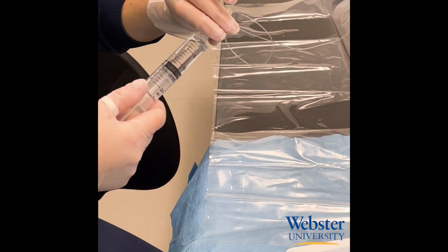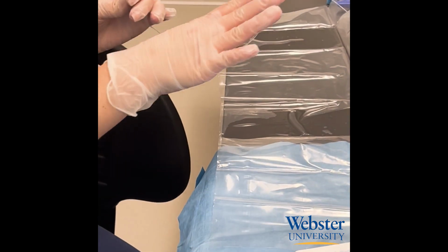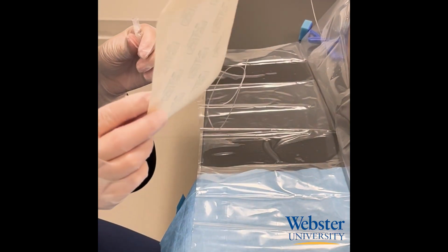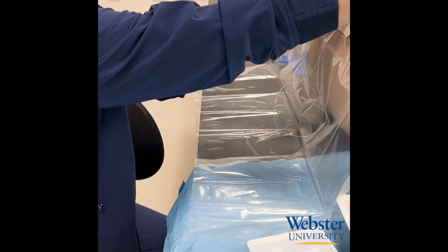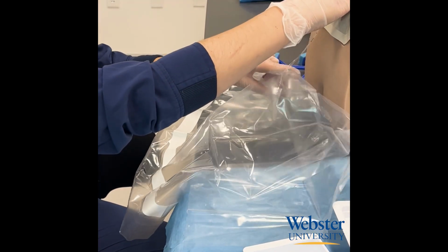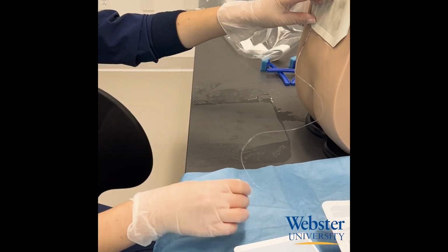While you're waiting for the block to set, the catheter can be secured. You want to put your dressing on and then remove the drape. You want to be careful not to take the catheter out as you're removing the drape. Secure the catheter very well with tape to prevent it from accidentally getting pulled out by the patient when moving.